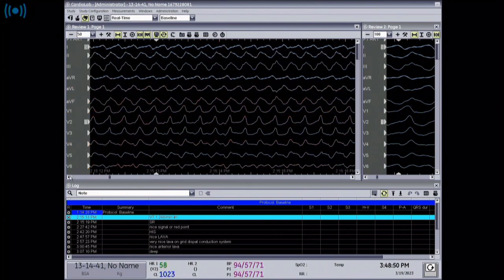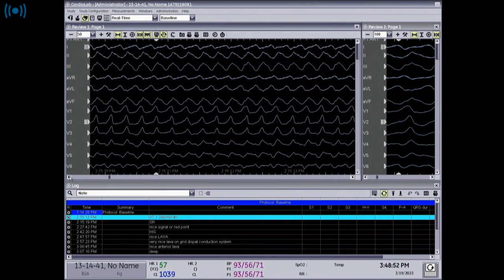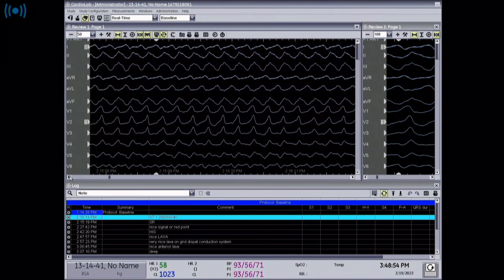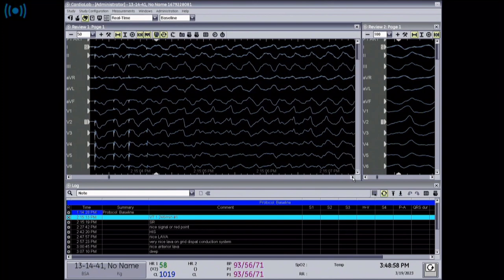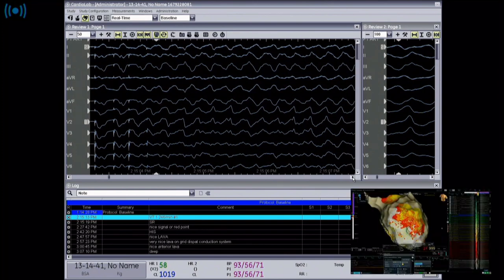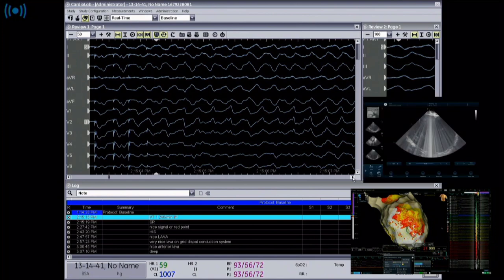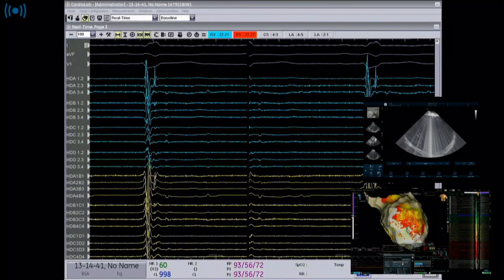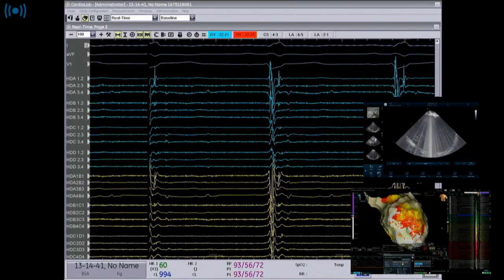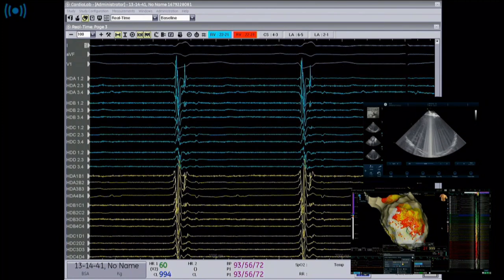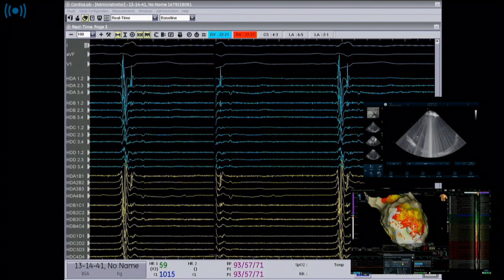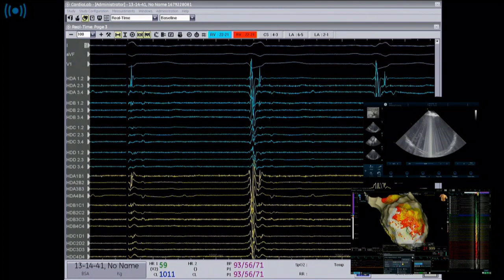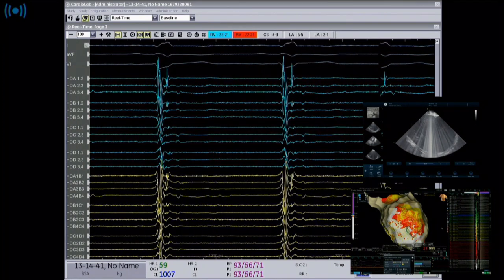Regarding the setup: we have general anesthesia for this case. We started with introduction of sheaths, we have intracardiac echo, RV pacing catheter, and use both transseptal and retrograde approach to have good access to all sites. Before doing any mapping maneuver, we went on to program stimulation.